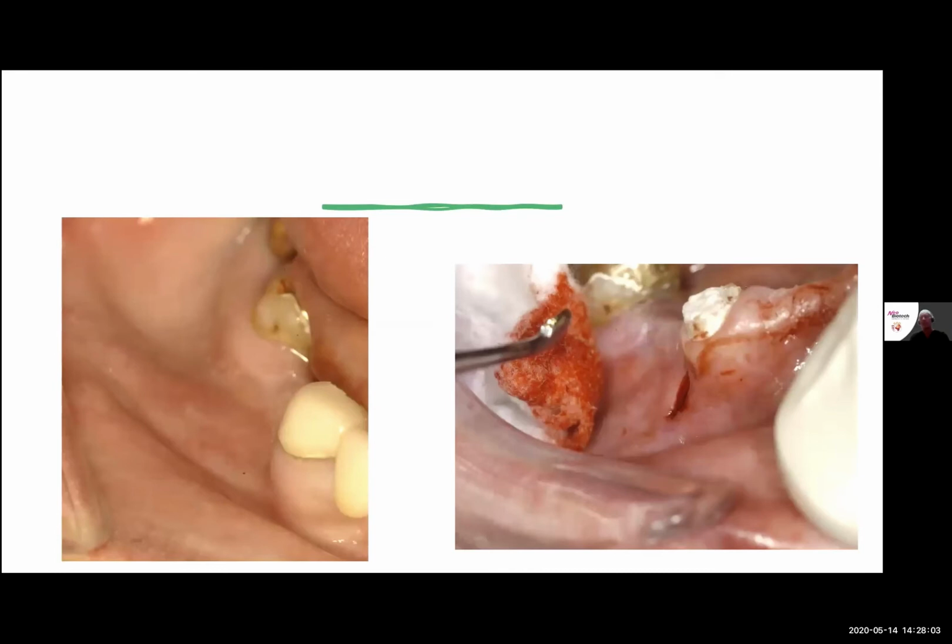Incision. Where do you make the incision? This is one incision or a couple of incisions based upon the length of the bone graft site that you need to have. The incision itself is made in only mobile tissue. And so if you have attached tissue that is here or right here, you are not making this incision up into the attached or keratinized. It begins at the mucogingival junction, and from there it goes apical. That's where the incision is placed.